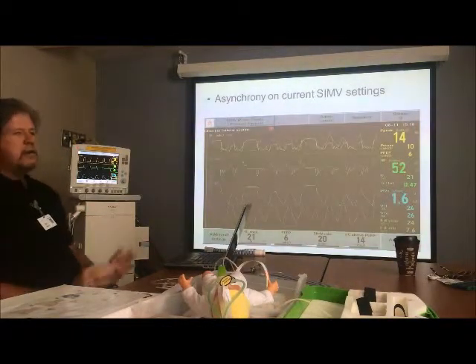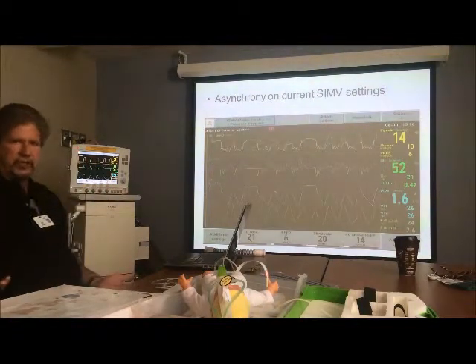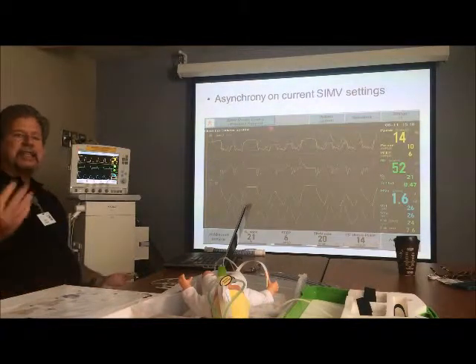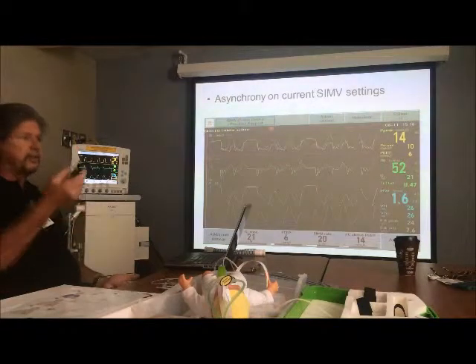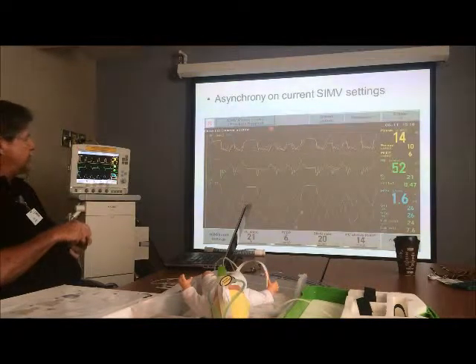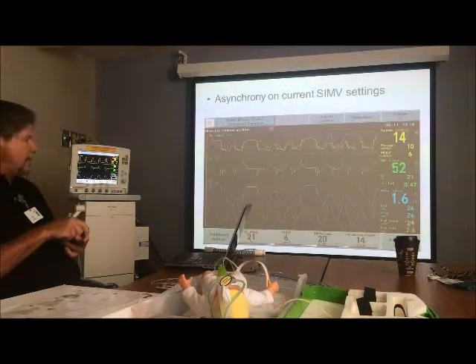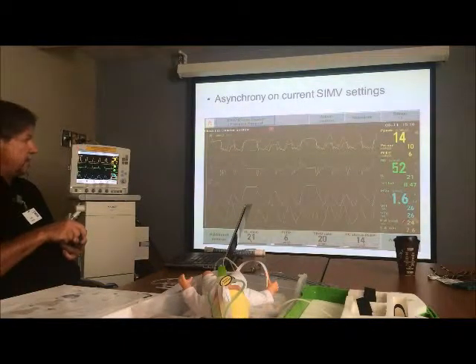But here's the beauty of using NAVA to its full potential when a patient is intubated. And you guys have seen this in the PICU in terms of the asynchrony associated with it, and all the asynchrony that I talked about: triggering asynchrony, flow asynchrony, and termination asynchrony. But with NAVA, here's what the EDI is. Okay, so here's the electrical activity of the diaphragm of this kid breathing, and here's the EDI of that kid down here. So remember I said normal was what? 10 to 15?